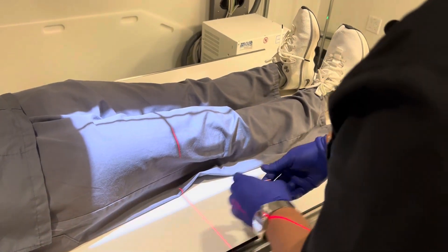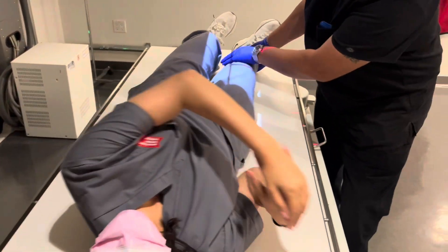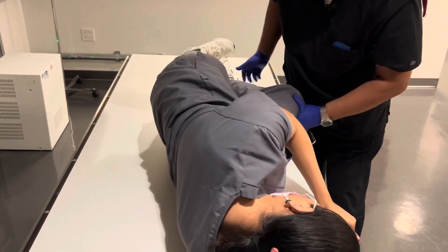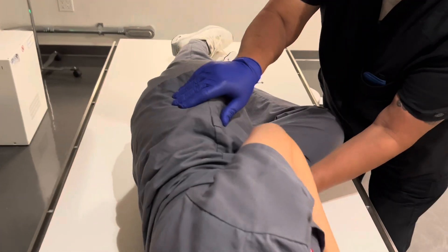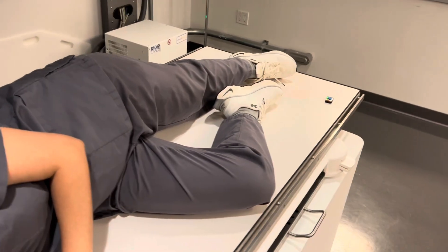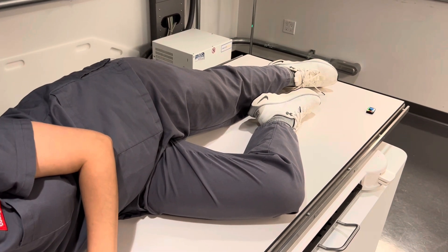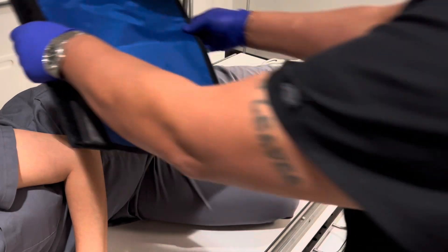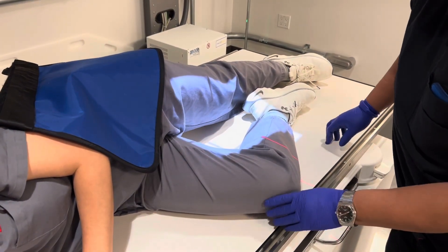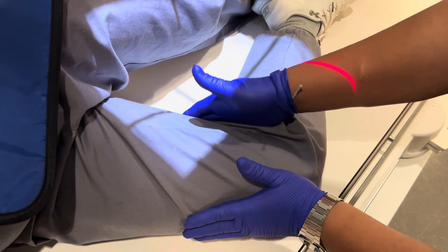For the lateral, we're going to have the patient turn over on her right side towards me and bend that knee. We can use a shield on her, so I'll grab a shield. I should have used a shield for the distal one we just did. Now we're doing the distal femur lateral. We're going to be two inches below her knee joint.